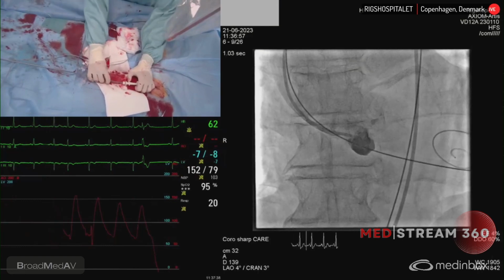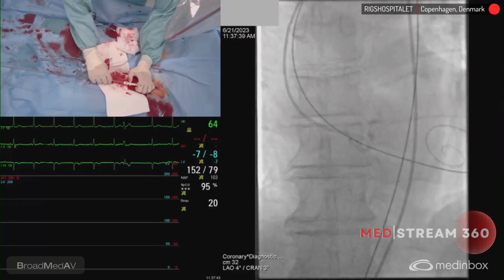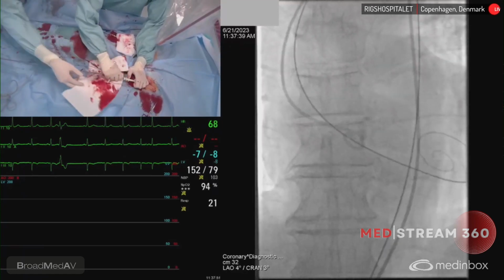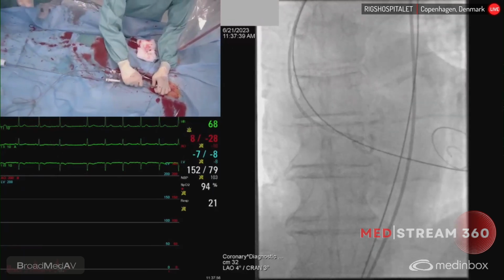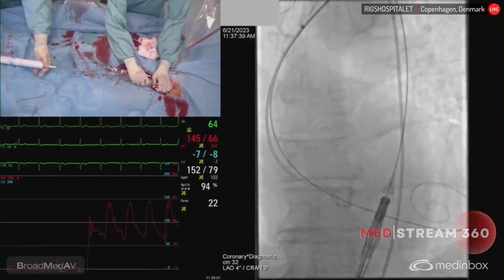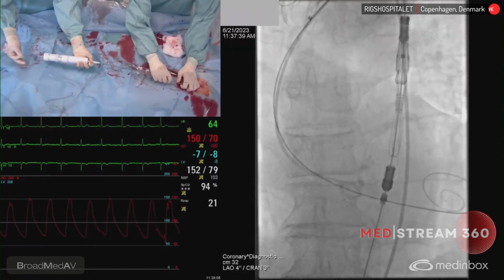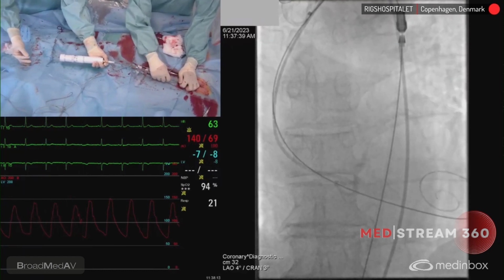Now he pushes the 30 centimeters device in, and then after that he will pull back on the loader. Yeah, it needs a little bit of force. Okay, loader back. We can park the loader there. Okay, slowly, guys. Yeah, pressure is there. You can cross the arch and then I will take over. Yeah, enable auto, because the placement is a bit more tricky.